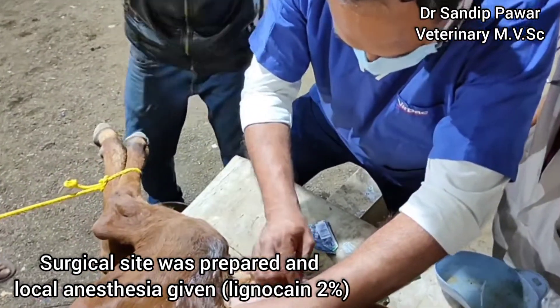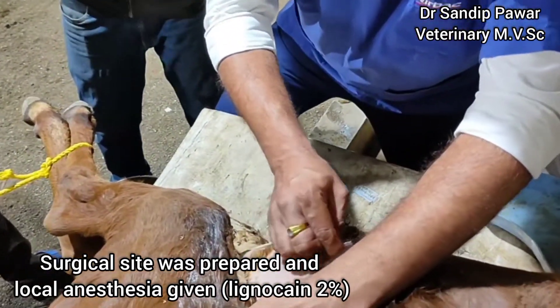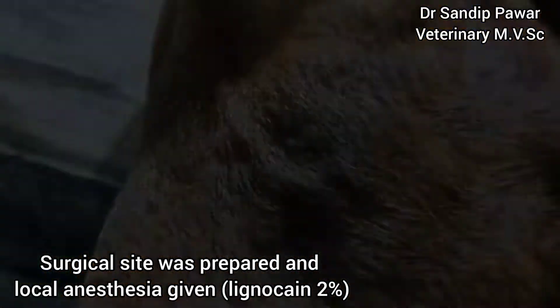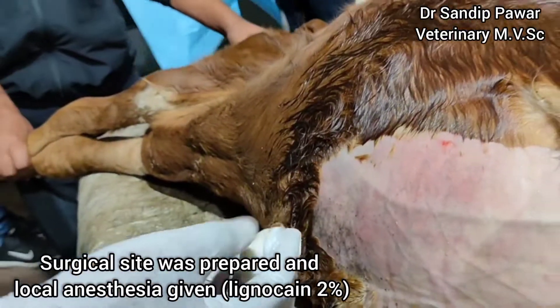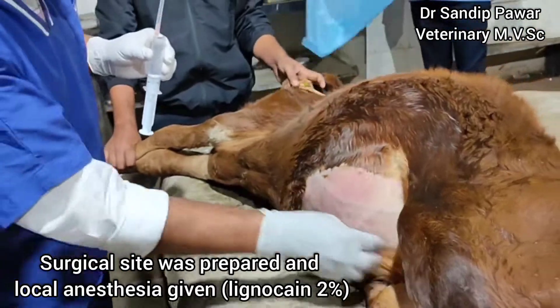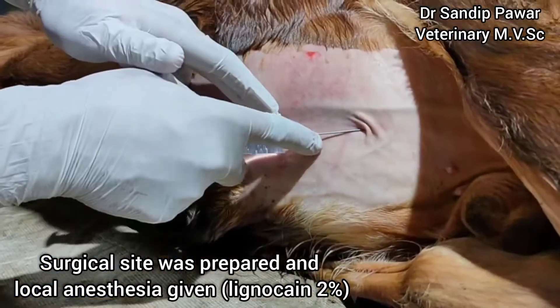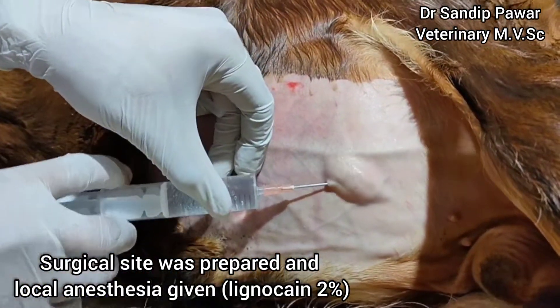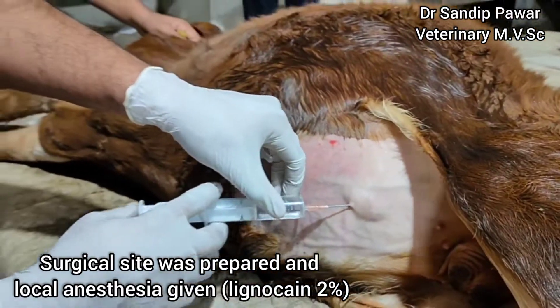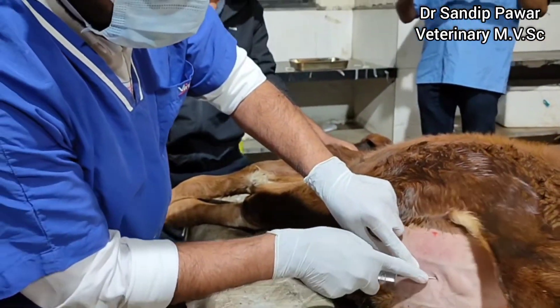The calf was put on lateral recumbency and the left side of the abdomen was prepared as a surgical site by shaving. Local anaesthetic 2% lignocaine was used for line infiltration anaesthesia.